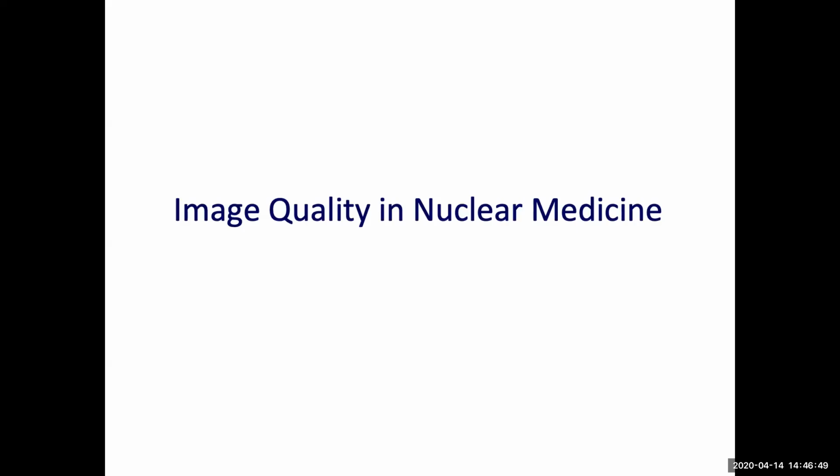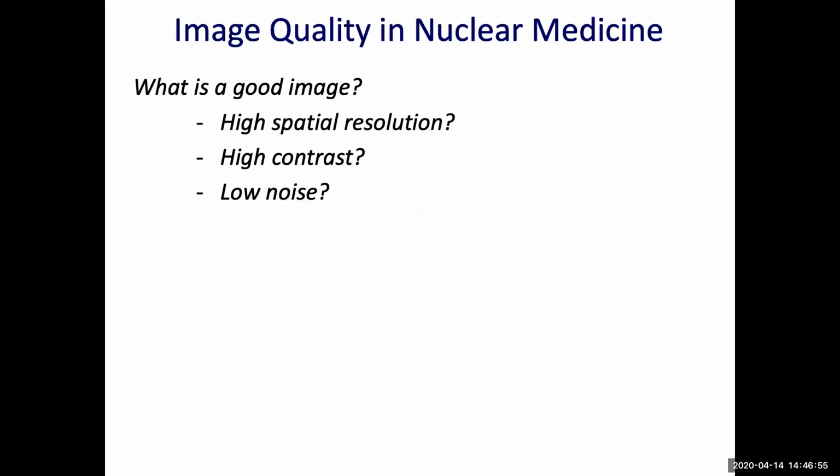Let's move to image quality in nuclear medicine. If we ask a question, as a radiologist or nuclear medicine physician, what is the good image for you? Is it the high spatial resolution, or high contrast image, or low noise image? What do you prefer? Yes, it's all, but you cannot get all of them together.